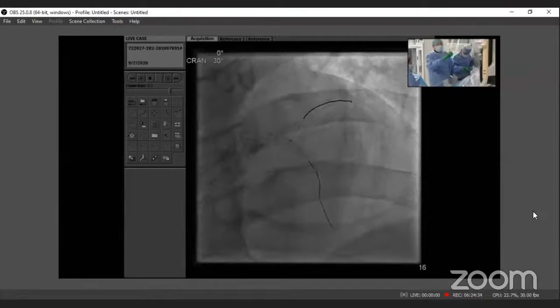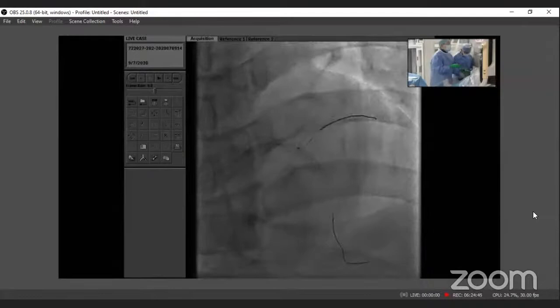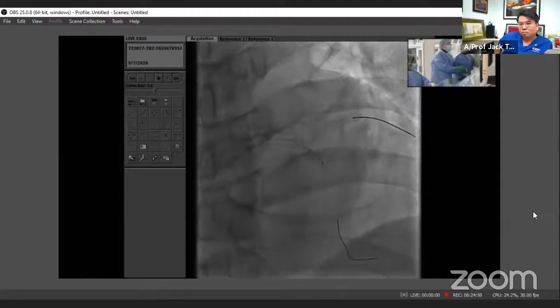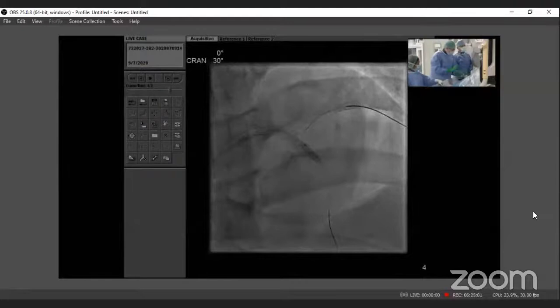It went down a little bit, but now the wire has lost position a little bit. So we're going to rewire it. Yeah, the third wire, please. Okay, now push down. We just do a gentle pressure here, not too far down. The balloon I did a little bit oversized. Okay, now before we do the thing, can we have the 3-0, please?